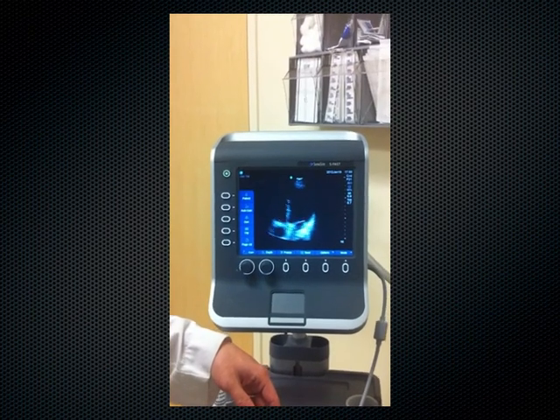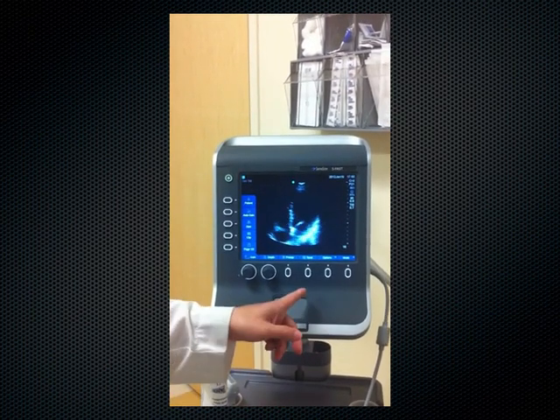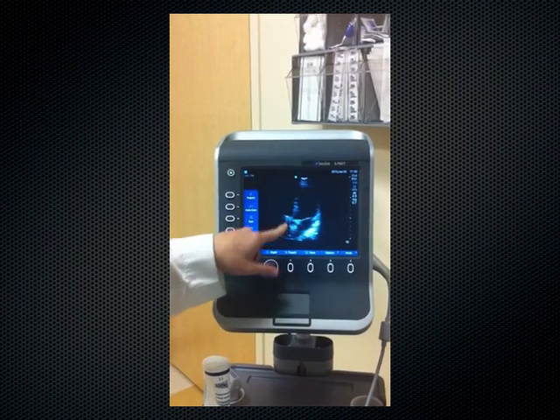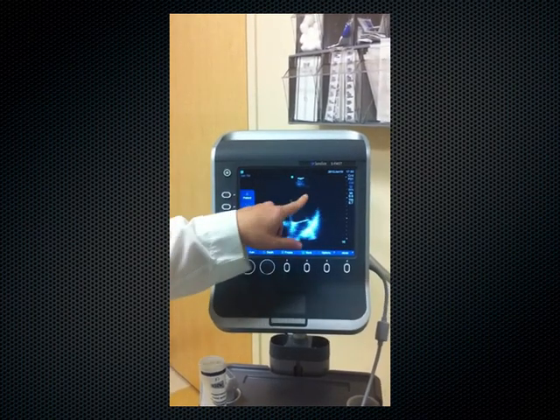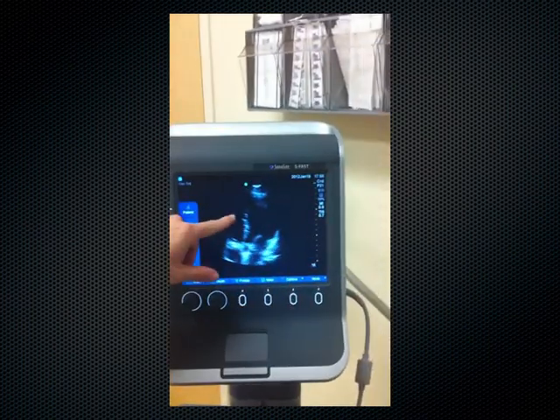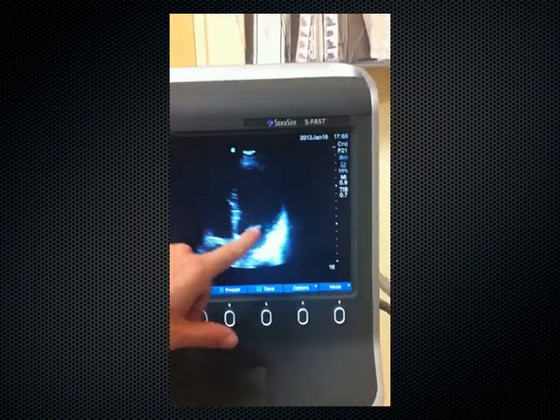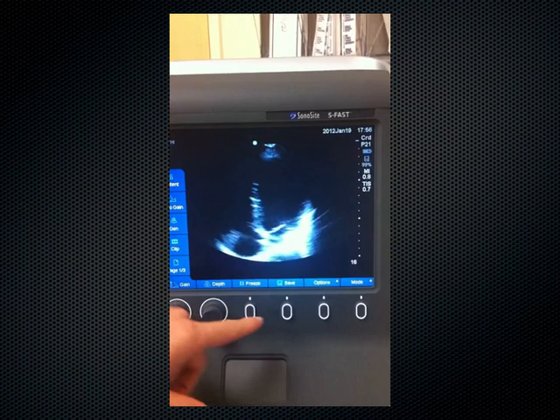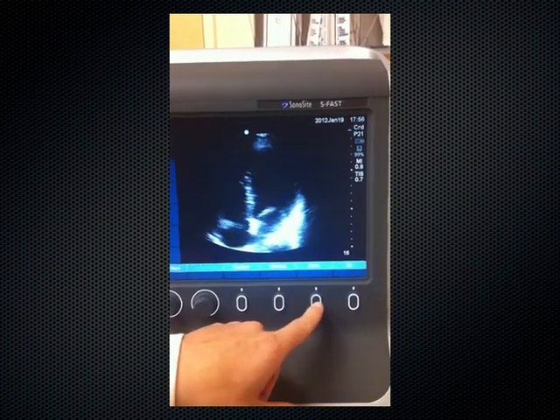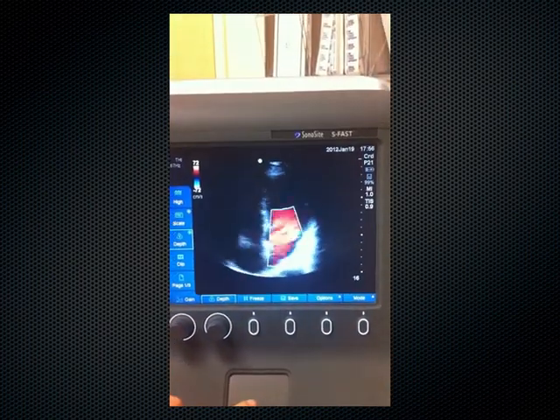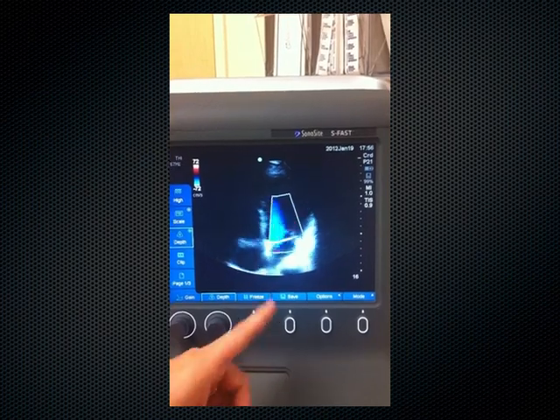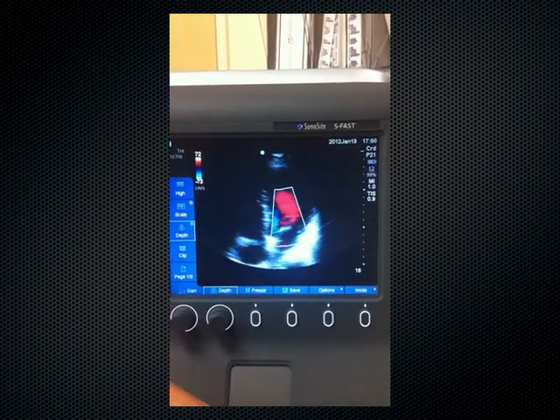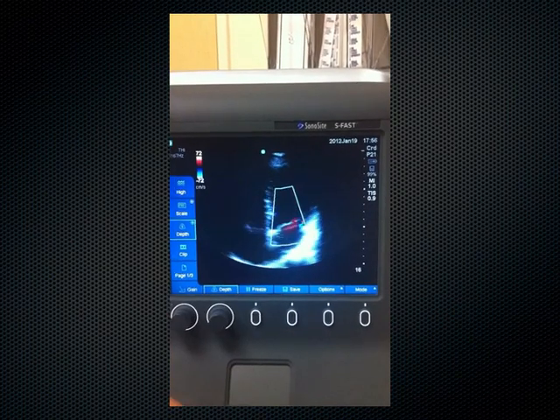We have a four-chamber apical view of the heart. This is the apex; on the right of the screen is the left side of the heart, and on the left is the right side. We have the left ventricle, left atrium, right ventricle, and right atrium, with our mitral valve and tricuspid valve visible. I'll put color Doppler through the mitral valve — flow is towards the left ventricle and there's no regurgitant jet visible on color Doppler.